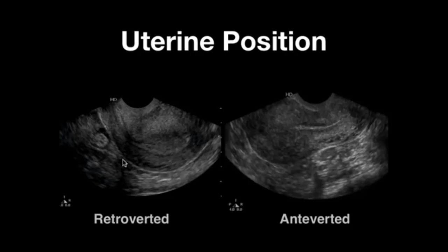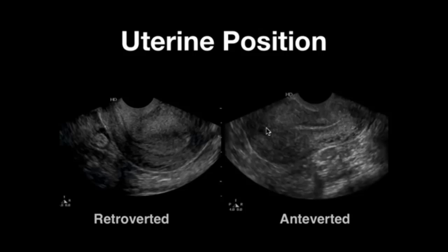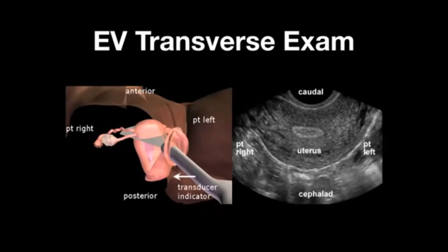Comparing two patients: on the left is a retroverted uterus — following the endometrial cavity from the lower uterine segment, you can see it courses in a posterior direction. On the right is an antiverted uterus — following the endometrial stripe up to the fundus, it courses in an anterior direction. For the endovaginal transverse or coronal exam, rotate the transducer indicator from the 12 o'clock position — thumb toward the ceiling — to the 9 o'clock position, with the indicator directed toward the patient's right thigh.